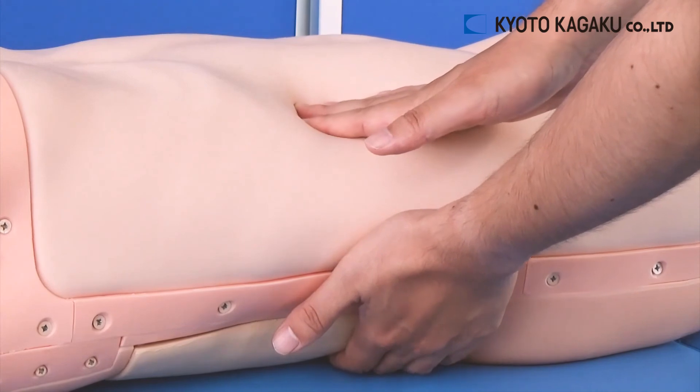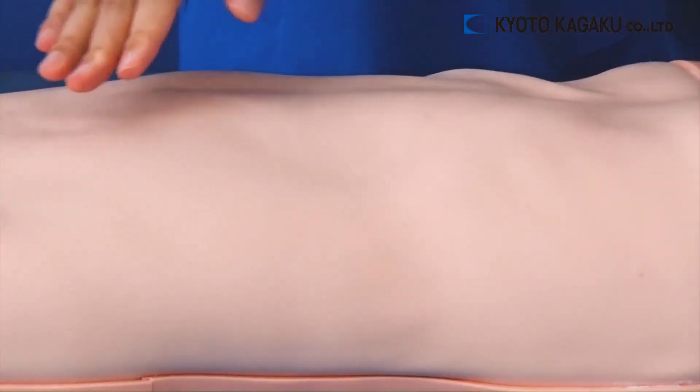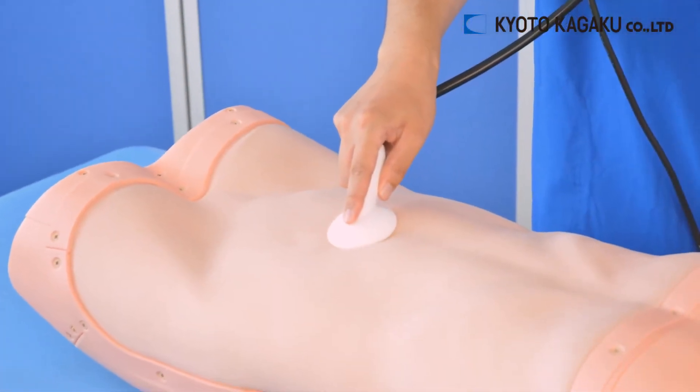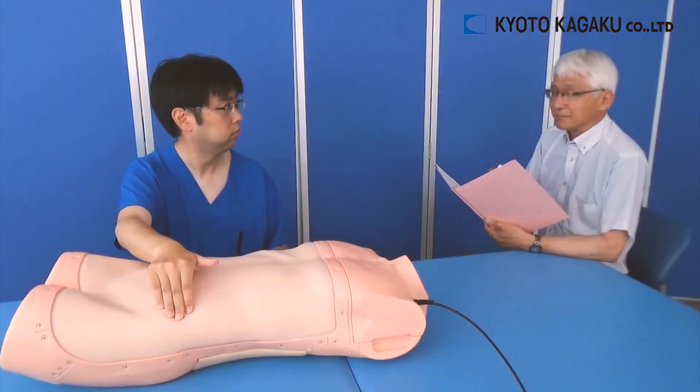Only with Abdo Abbey can you practice visual diagnosis, auscultation, percussion, and palpation. We believe that Kyoto Kagaku's Abdominal Examination Simulator, Abdo Abbey, is an indispensable teaching tool for you.